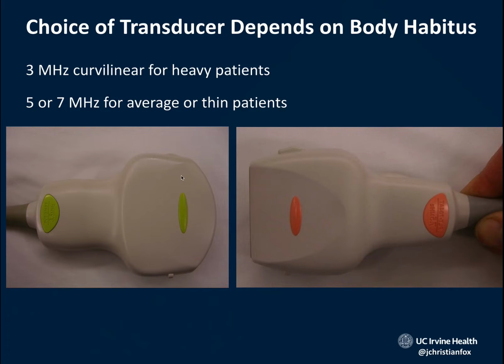Now, when you've got a larger patient or if you're looking at small bowel, I think this is the best probe to use for small bowel obstructions, differentiating small and large bowel obstructions, and also depending on the patient, the appendix. So in larger patients, I would use this probe for the appendix, and in smaller, thinner patients, I'd use this probe. Do I have a certain number, a size, a BMI?